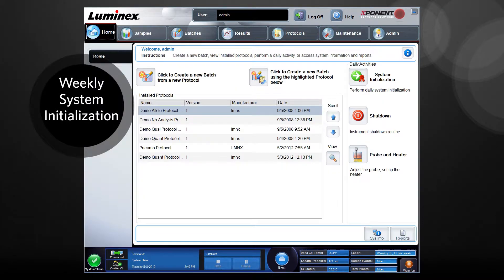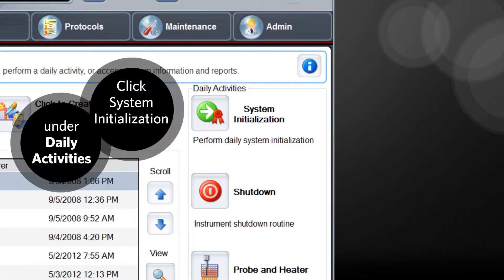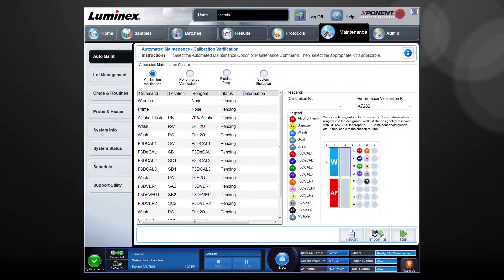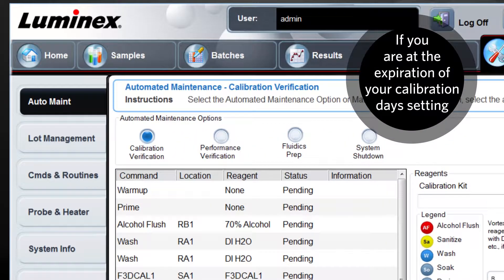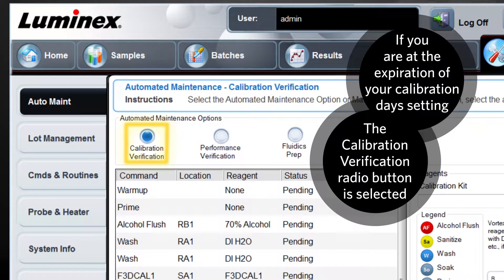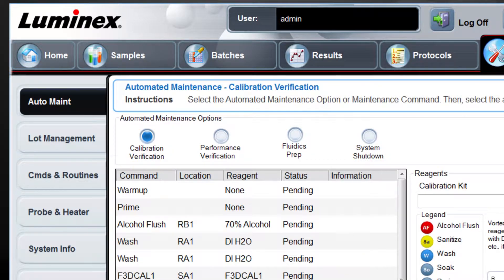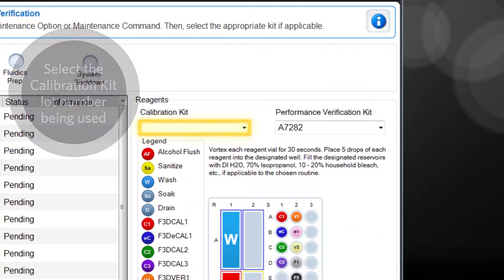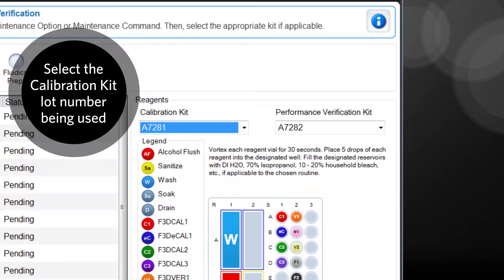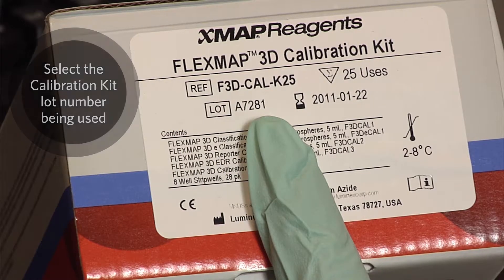To run a weekly system initialization, from the home page, under daily activities, click system initialization. If you are at the expiration of your calibration days setting, the maintenance page opens on the auto maintenance tab with the calibration verification radio button selected automatically. This ensures that you run a calibration at the system initialization once a week. From the calibration kit dropdown box, select the kit number you are using. This number is located on the reagent vials and calibration kit box.